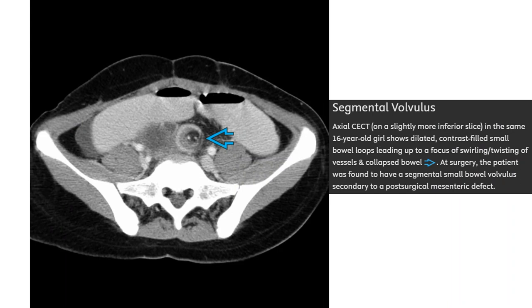Contrast-enhanced CT in a 16-year-old girl shows dilated contrast-filled small bowel loops leading to a focus of swirling and twisting of vessels and collapsed bowel. At surgery, the patient was found to have segmental small bowel volvulus secondary to a postsurgical mesenteric defect.